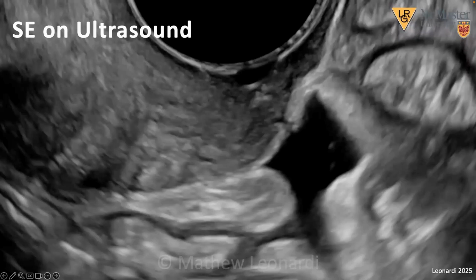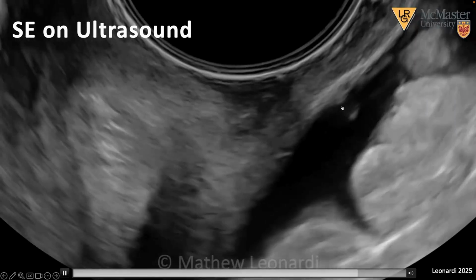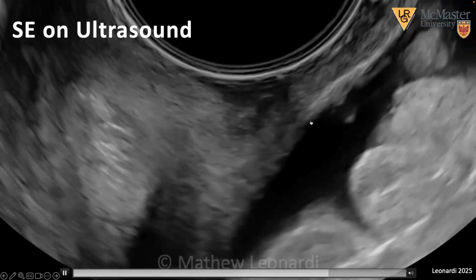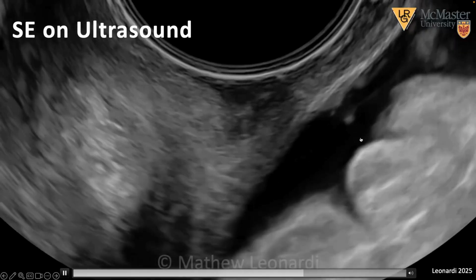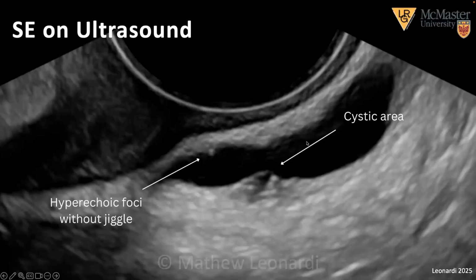In some instances, we have even cystic lesions, and this is on the peritoneum. Again, we're at the back of the vagina here. This is the peritoneum in that central aspect of the pelvis. And with the application of pressure, you see the jiggling of this cystic lesion growing off of the peritoneum. Sometimes we have cystic lesions that are more within the peritoneum rather than immediately coming off, but you can definitely see this breaks that surface as well, followed by a hyperechoic focus just on that peritoneum there.